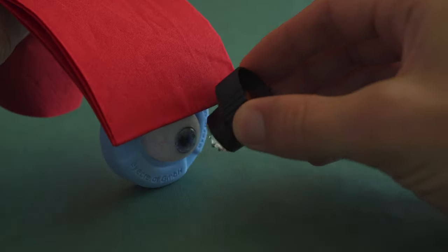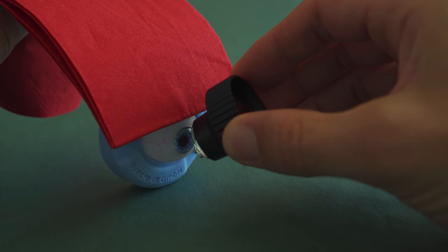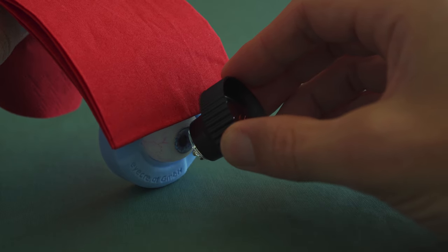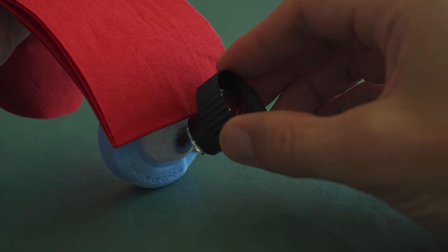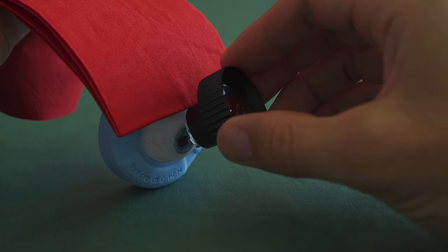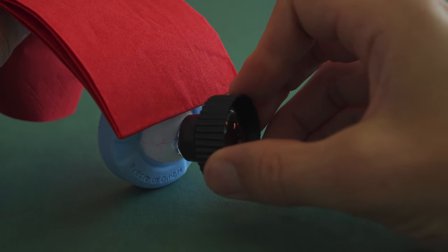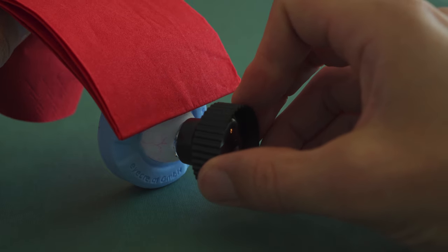To put the lens on the eye, just have the patient look up, tilt the lens down, and then use the rim of the lens to push up the patient's upper lid and put it directly on the cornea.